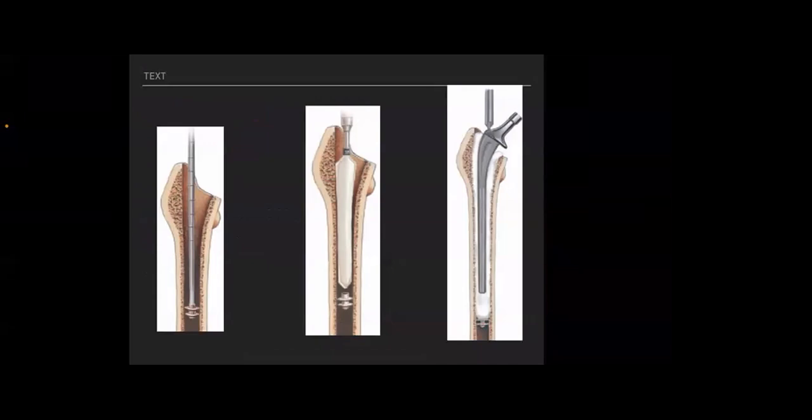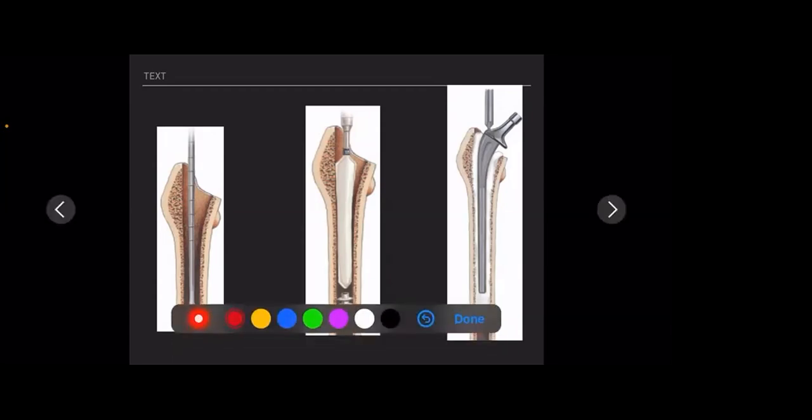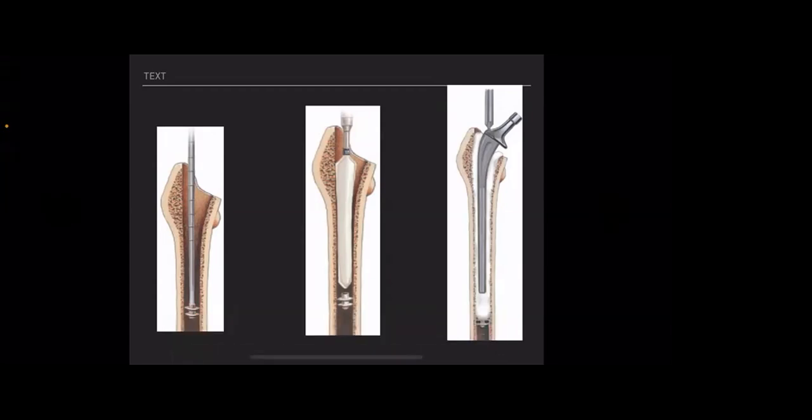So try to be sure, ask your company fellow what the setting time is, so that you are doing every step at the right time. Many people, because of too much worrying, insert the cement too early, so it is all liquid, and once they insert the stem, the whole thing spills out. Many people insert it too late, so that it is solidifying already, so the stem sits proud. You cannot really position it properly.